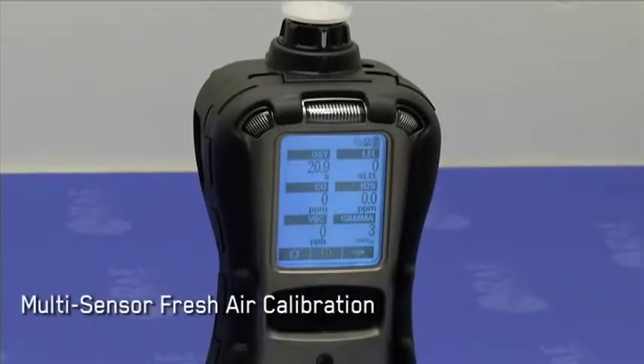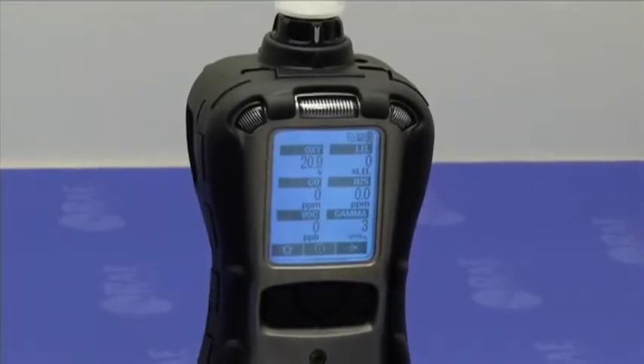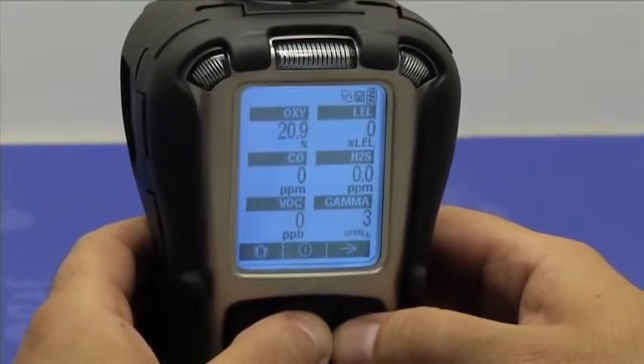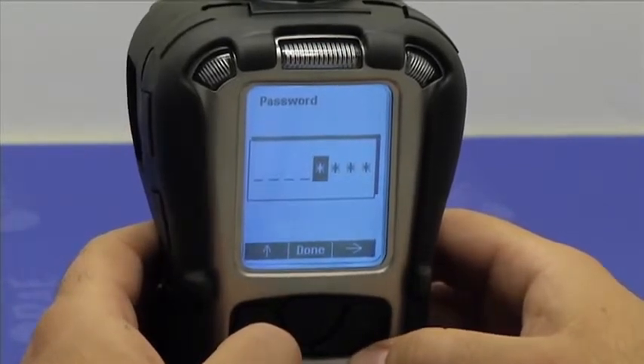So let's perform a multi-sensor fresh air calibration. To do so, we need to enter the programming menu. Press the mode and the end button simultaneously until the password screen appears. The default password is 0000.